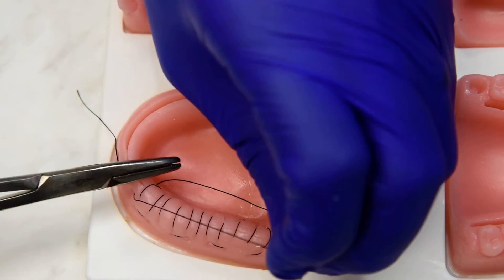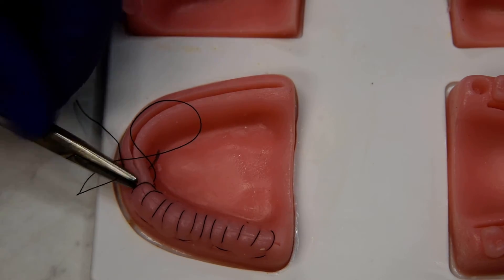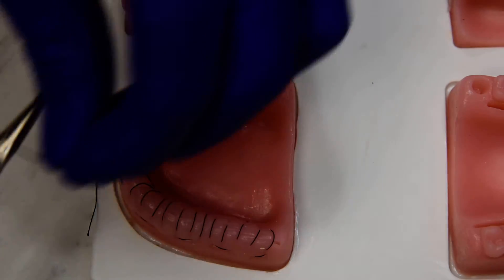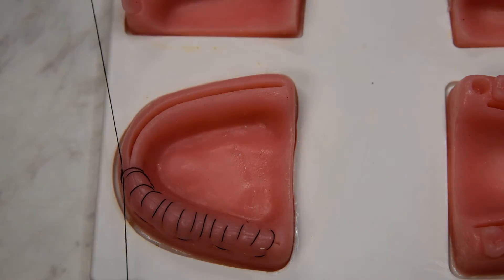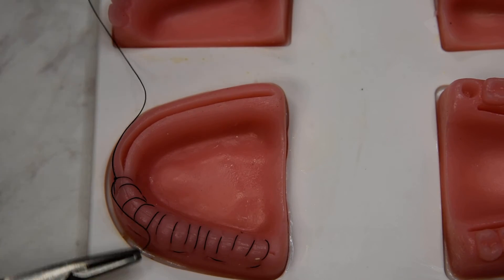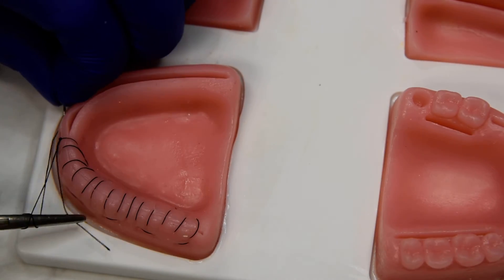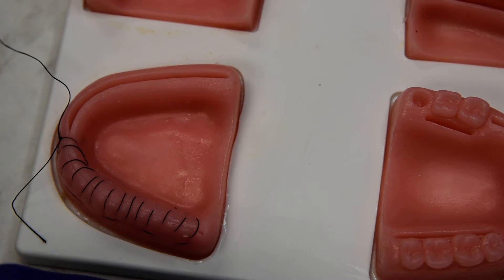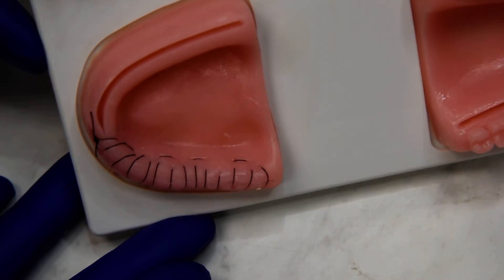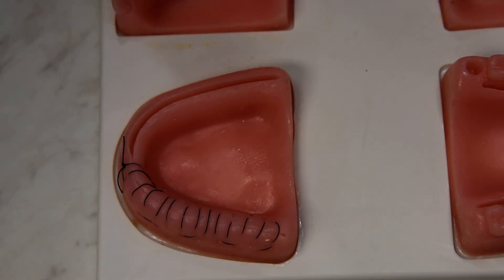You should be able to do it all with one suture if you space it out well. So our final throw here at the midline, and then we're going to tie to the original knot so we have two knots on one spot. Keep our knot on the buccal, cut our tails. And that's a nice way to close a quadrant — the loops of the mattress deep to the final closure over the incision line: the Texas Two-Step.